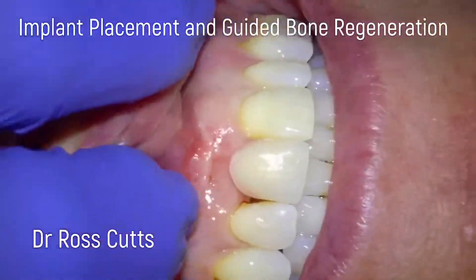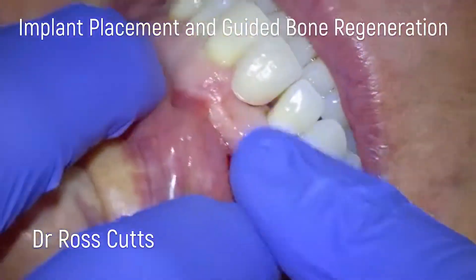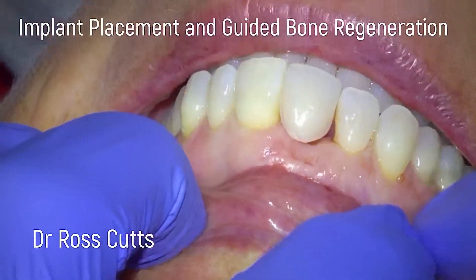Hi, my name is Dr. Ross Cutts and you're watching my video on placing a Straumann BLT implant with guided bone regeneration.